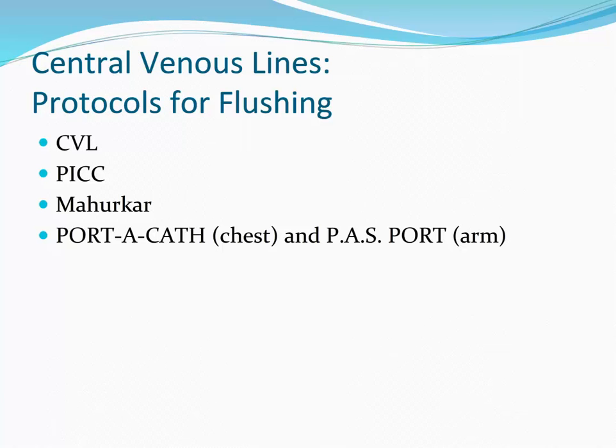PICC line: flush with 10 to 20 milliliters of normal saline. A pigtail should be flushed with 10 milliliters after infusion and 10 milliliters after blood draw. When not in use or locked, inject 2.5 ml of heparin, concentration 100 units per ml, to maintain patency, per MD order.